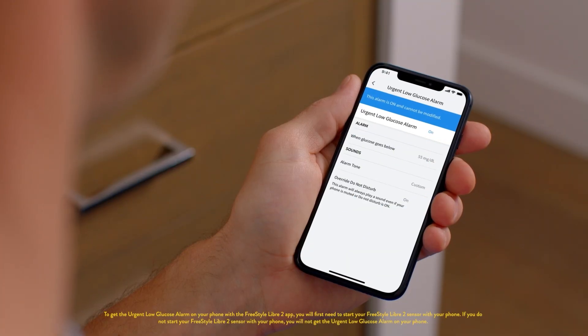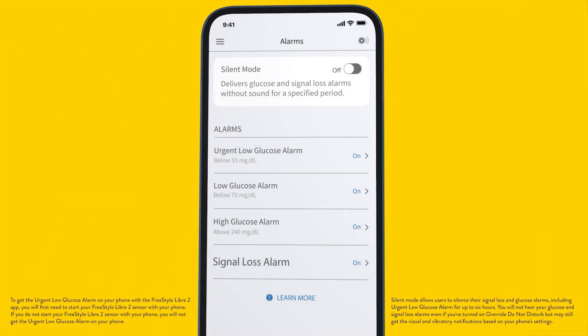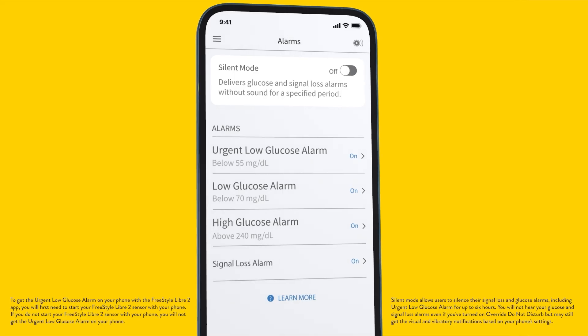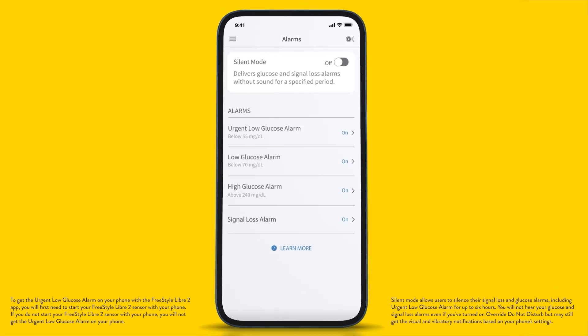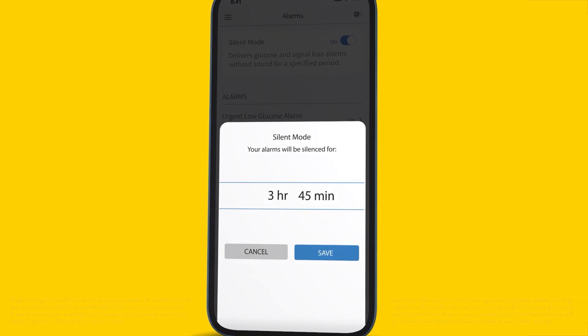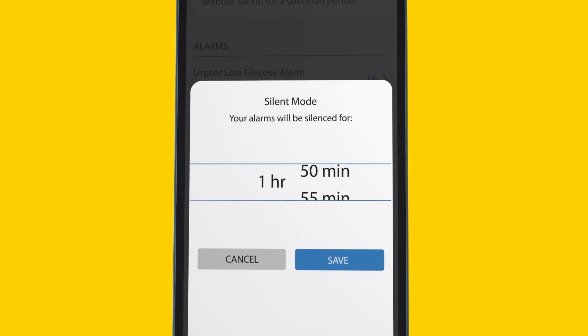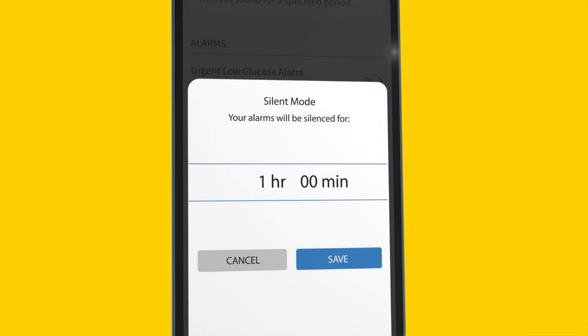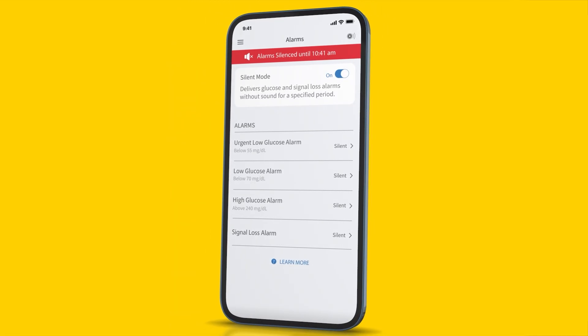The urgent low glucose alarm is mandatory and cannot be turned off or modified by the app user. With the silent mode feature, users can silence their signal loss and glucose alarms, including urgent low glucose alarms. Turn silent mode from off to on. Alarms can be silenced for up to six hours in five-minute increments. Select the desired duration and tap save.